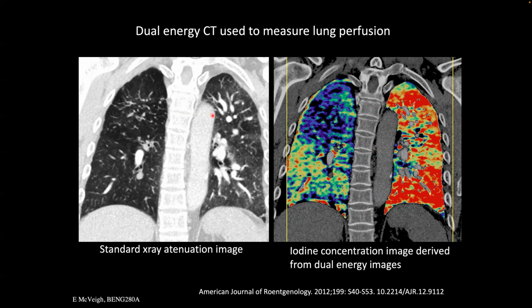If you look at the raw CT in this, now you take a 3D CT of this person's lungs, and now we're cutting it in the coronal plane. So we're cutting it down this way. So we're looking from the patient's top, their chest down. And I don't know, can you see that on your screen? Is there a difference between this and this? Other than the fact the aorta is here. But you can see, right, that this actually just looks darker than this. There seems to be a higher baseline level signal here, right?